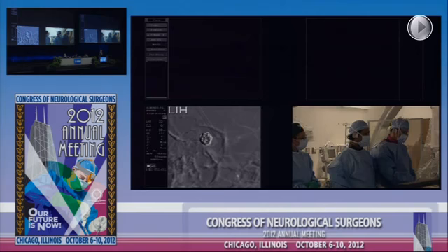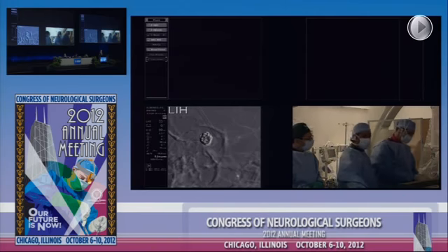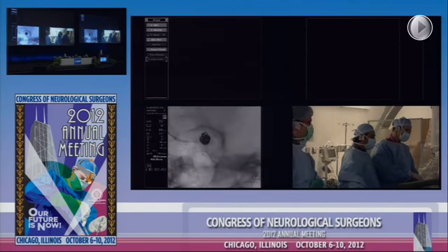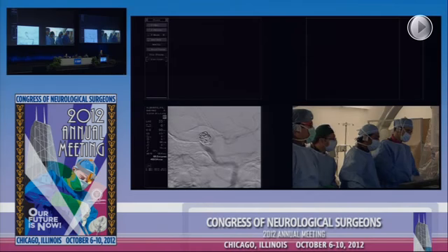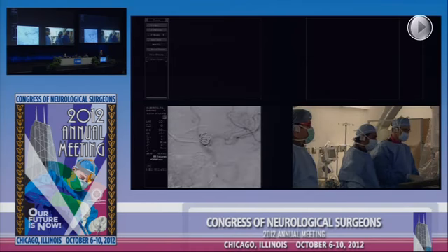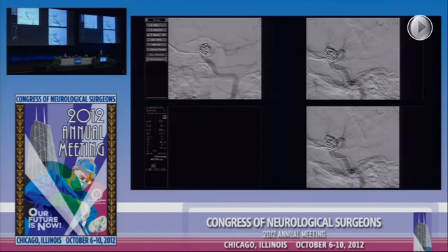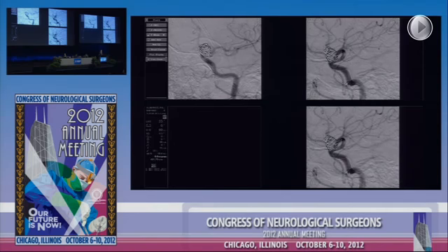I have it ready. Hold your breath. Can I have a run, please? Hold your breath. Great. Can you clean that up, Jane, and freeze it in the mid-arterial phase, and we can take a good look? Oh, that's beautiful.